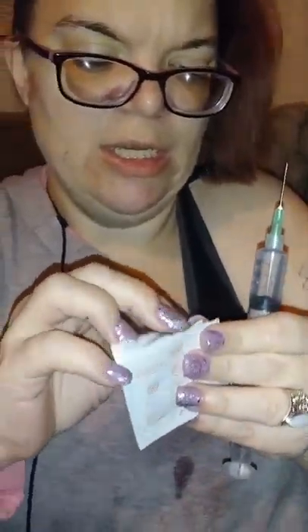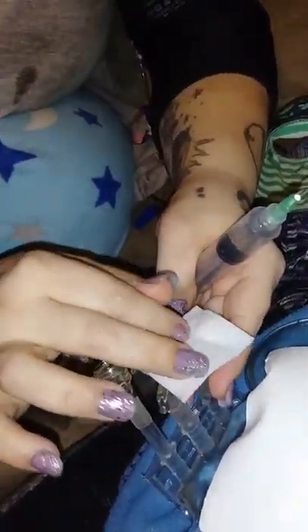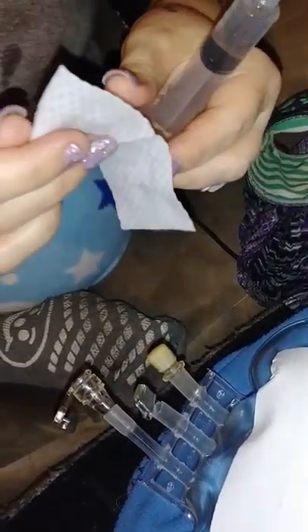The next thing I'm going to do is grab an alcohol prep. And as we jokingly say, scrub the hub. So I do flip the rubbing alcohol around — three times is generally what I do.